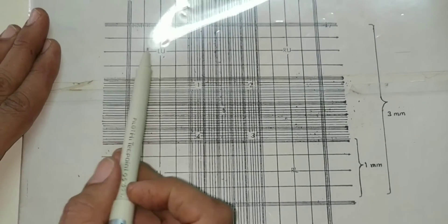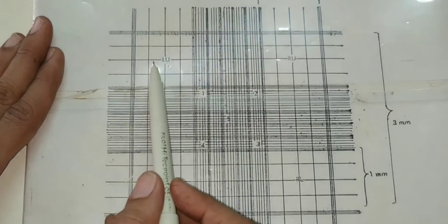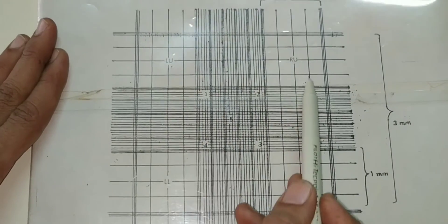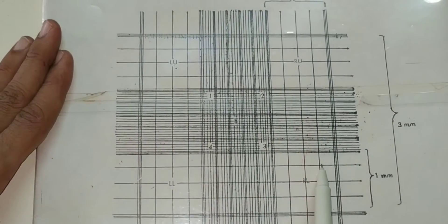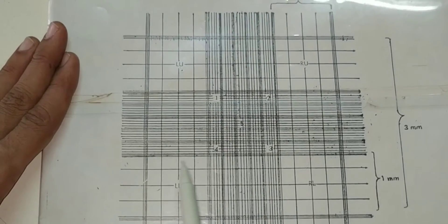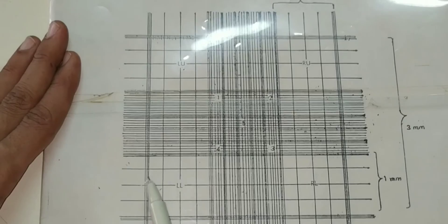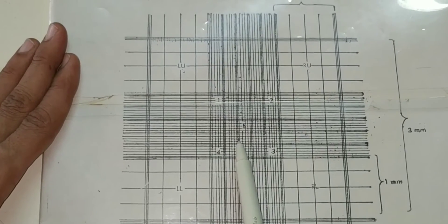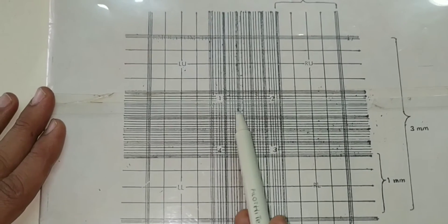The counting grid is further divided into 9 large squares, each having an area of 1 mm². Of these 9 squares, the 4 corner squares are employed for counting WBCs, and these are further divided into 16 medium-sized squares. The central densely packed square, known as the RBC counting square, is further divided into 25 medium-sized squares.